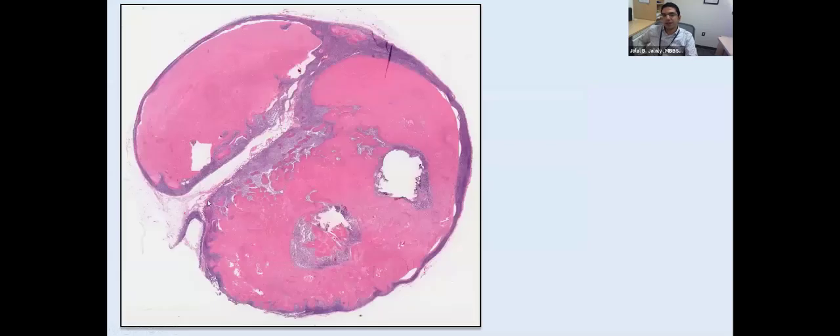So here is the lymph node that was previously FNA'd and biopsied, and you can appreciate how cystic it is with only a rim of lymphoid tissue and lining epithelium. But within the cyst, you can appreciate also quite the complexity with some septation and some solid areas, and those features will become important when I talk later about the radiology of these lesions.